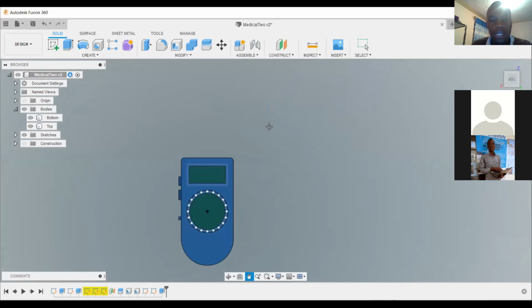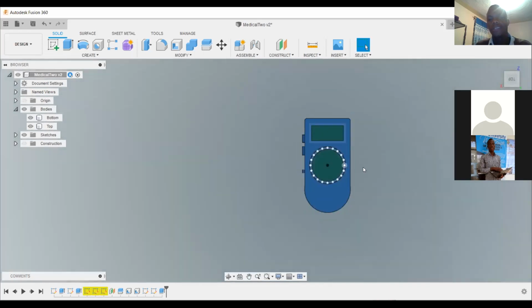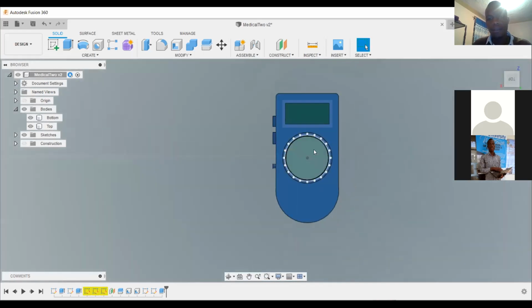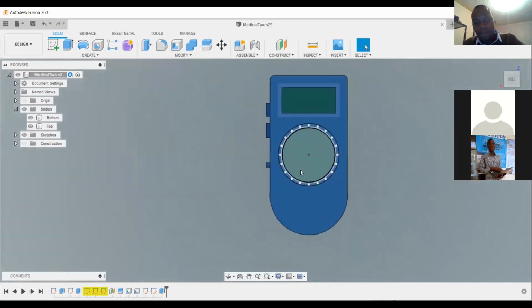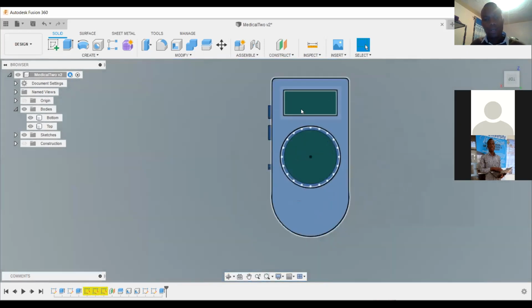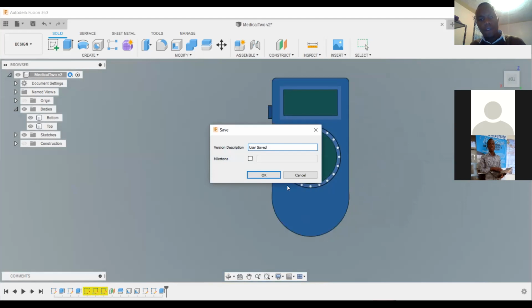And I told you, you can change that. So this is how the device looks like. It looks like a Walkman or some music system. But anyway, there's a screen there, then there is this circular part. So you can be able to look at that. Can you guys show me whatever you've done?